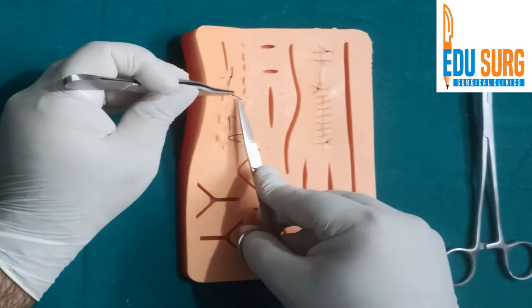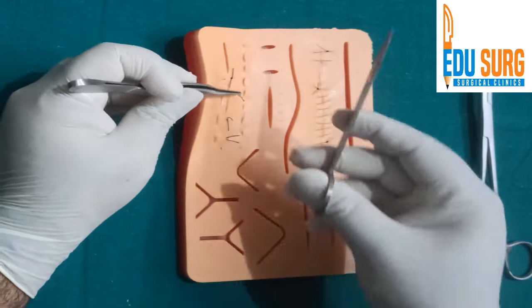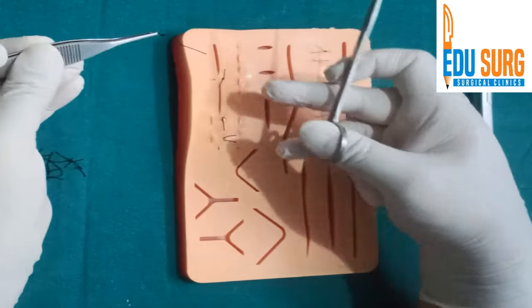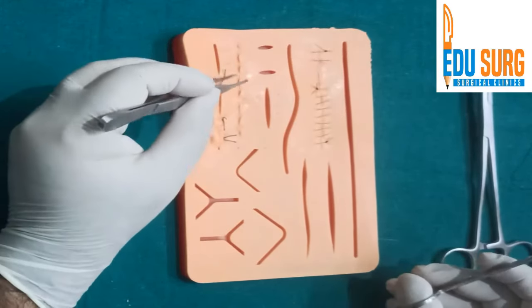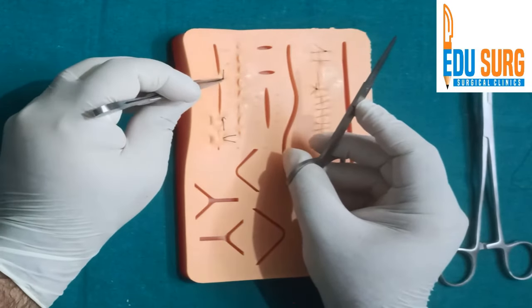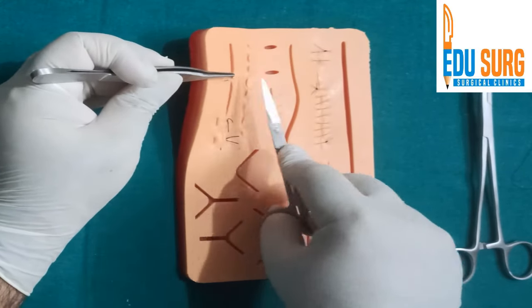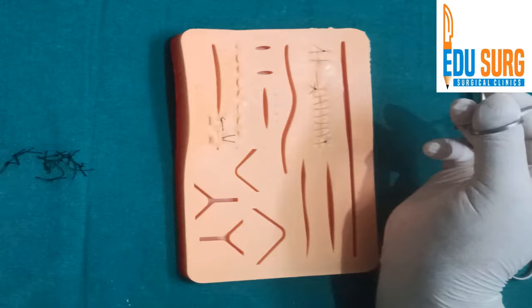The most difficult one to remove is the horizontal mattress, because they are everting stitches. Many times you are not able to find the end that you want to cut, and it is quite painful to remove horizontal mattress stitches. The principle remains the same: hold, pull, cut the part that is buried in the skin, and take it out.